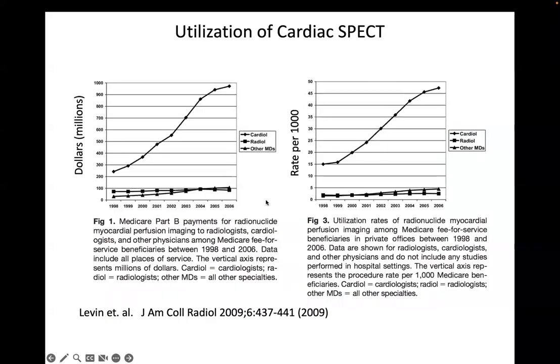So this imaging technology is fascinating from an economic standpoint and from a medical practice implementation standpoint, in that its growth over 10 years or a decade was absolutely astronomical. A few papers were written in the mid-90s showing that this was a good way to predict who needed further intervention in heart disease versus those people who didn't have a flow limiting lesion in their heart.